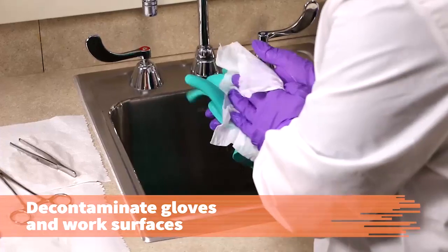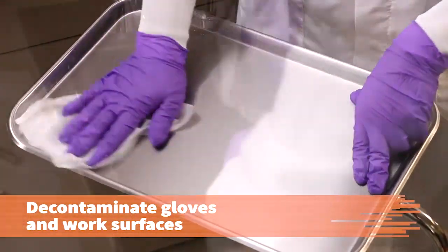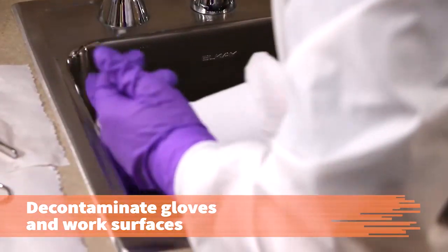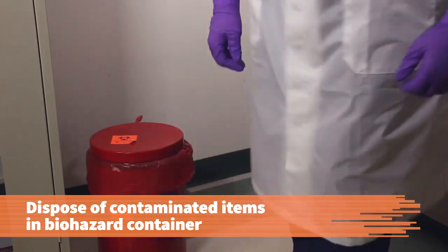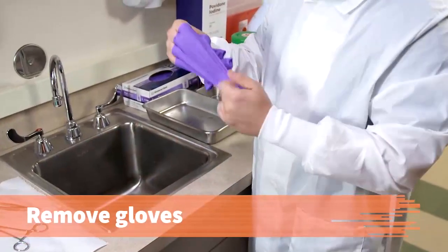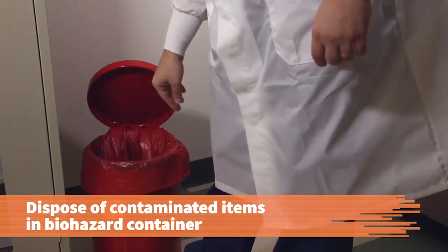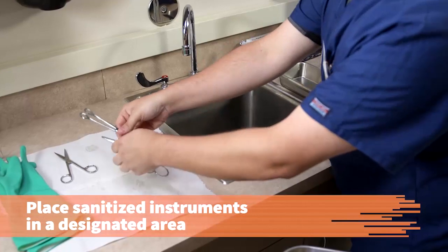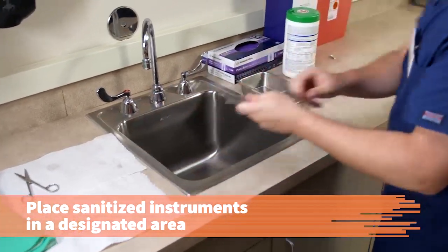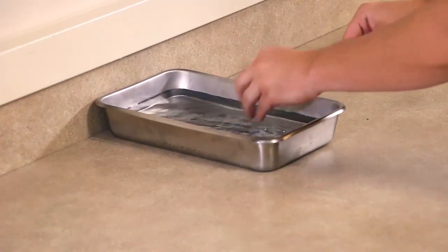Decontaminate the utility gloves and all work surfaces using disinfectant cleaner to prevent transmission of infectious organisms. Dispose of the contaminated towels in a covered biohazard waste container. Properly remove and dispose of PPE in a biohazard waste container. Sanitize your hands. Place sanitized instruments in a designated area for disinfection or sterilization to prevent possible cross-contamination.